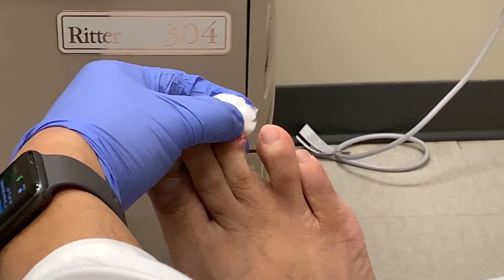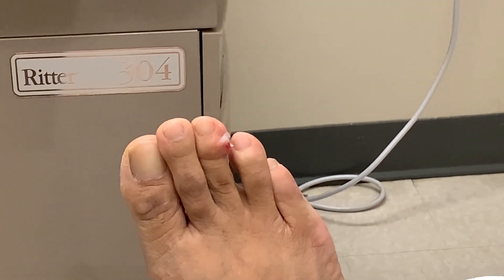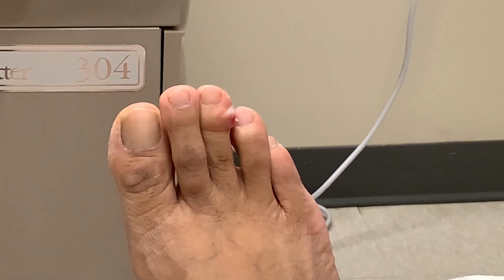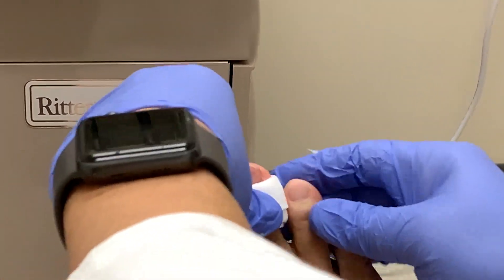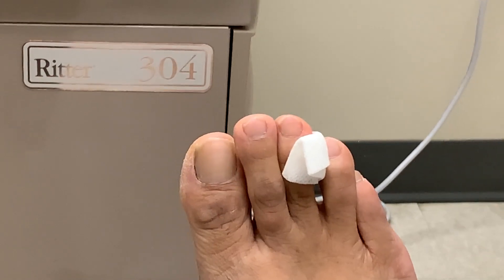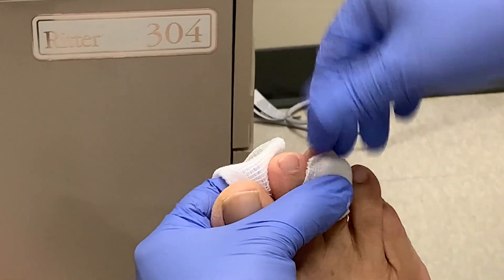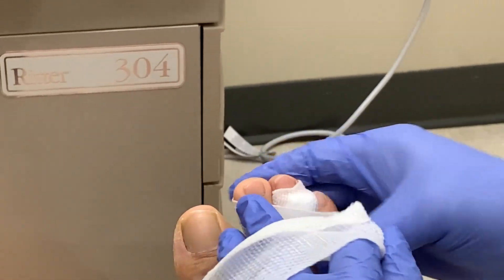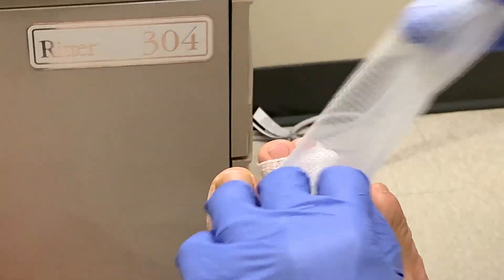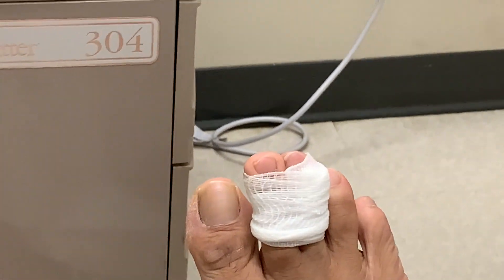Then he proceeds to put antibiotic cream on the area, then proceeds to dress it up. And that's it — it's that simple.